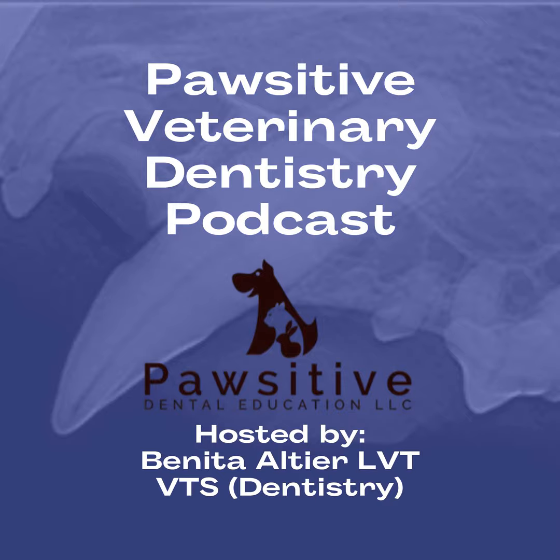I mean, unless 90% of the crown is missing and it's obvious, but that is where some of those things cause an issue and cause either overinterpretation or underinterpretation of other things, especially in cats too. Concentrating and focusing on that periodontal ligament space, on whether it's present or absent, is going to give you an indication as far as what potential treatment options you have, especially when there is evidence of tooth resorption too.